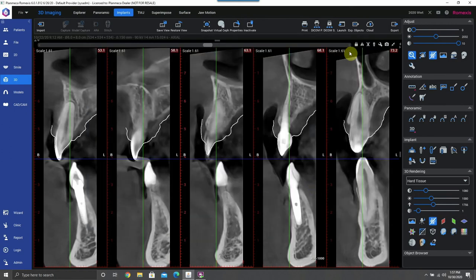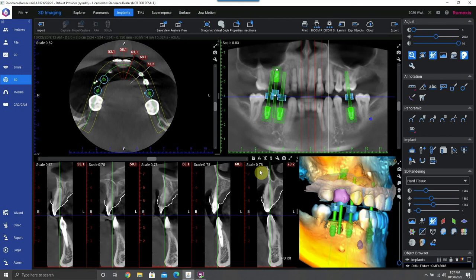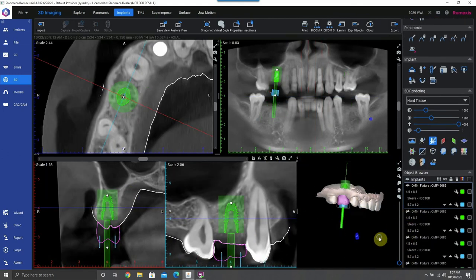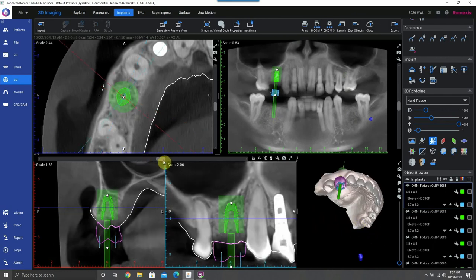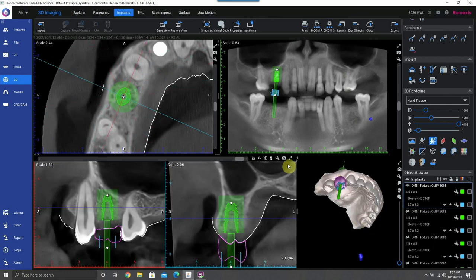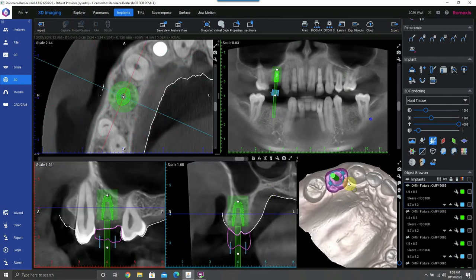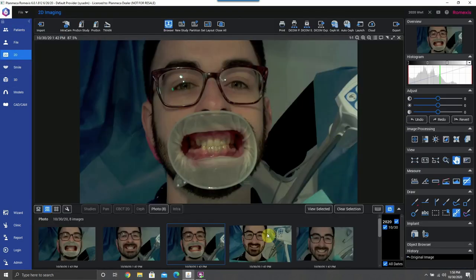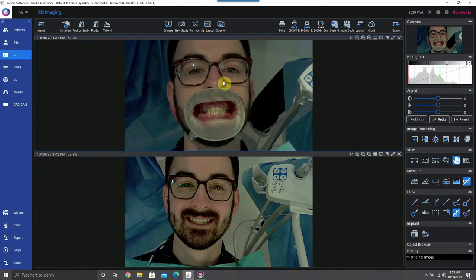So now we merge the intraoral scan. We merge the diagnostic wax-up for that site number 4-5 area. And we can explain to the patient, this is why you need a molar-shaped tooth. You don't have enough room for two implants there, even though you're missing teeth 4 and 5. We can explain all that kind of stuff and help them understand.